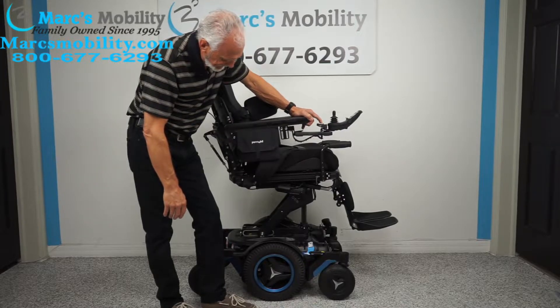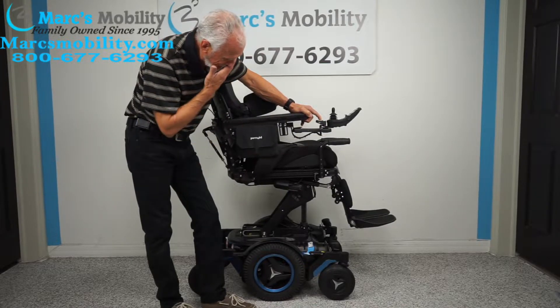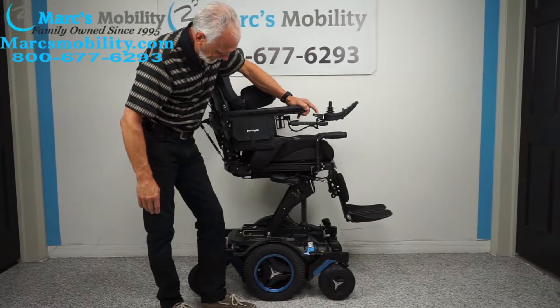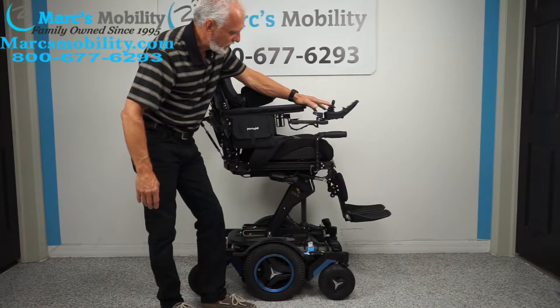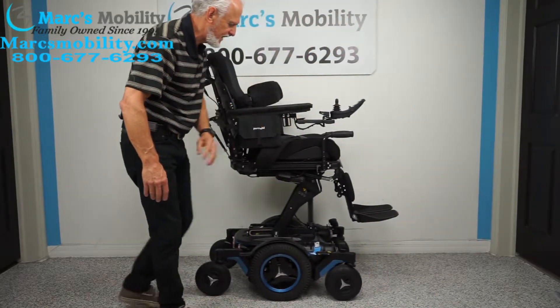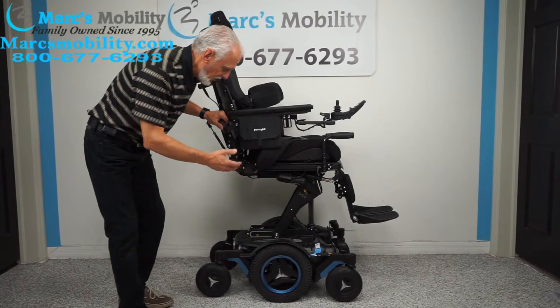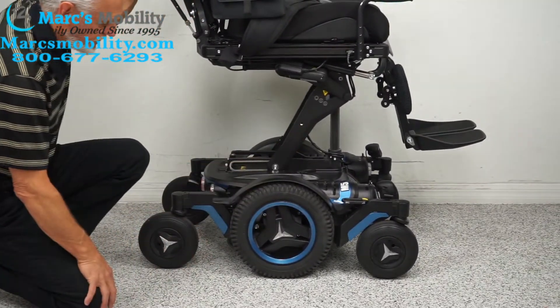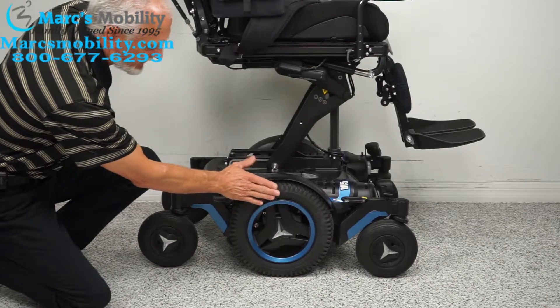Once the seat is elevated all the way to the top — there, 36 inches — you can still drive the chair at a good speed with the seat elevated, which I'll show you outside. Looking at the base, you can see this is a gorgeous power chair. We have 14-inch solid tires that are not going to mark your floor.